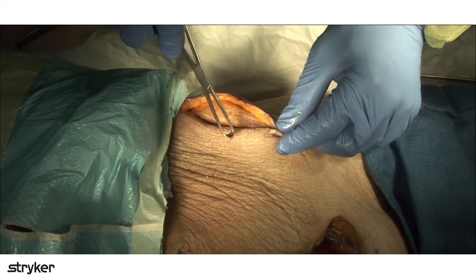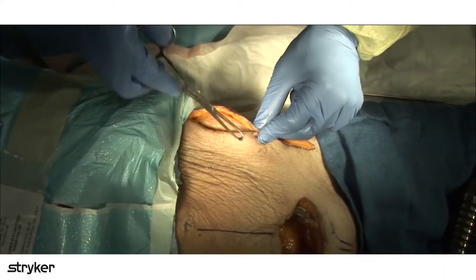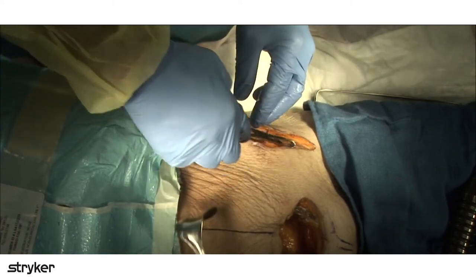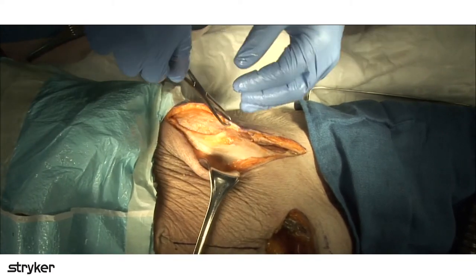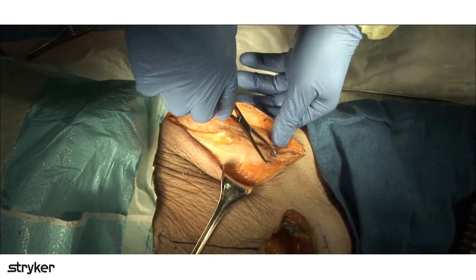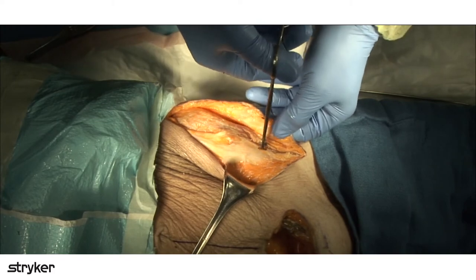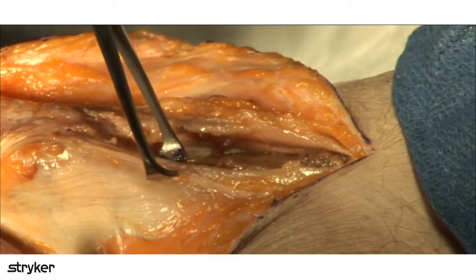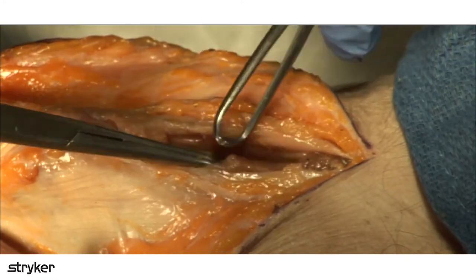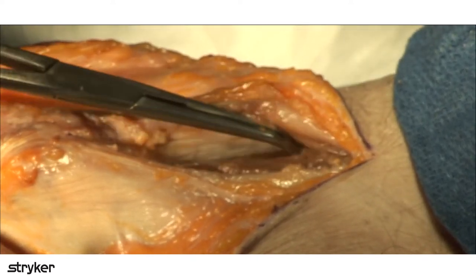But if you're going to do the ASIS osteotomy, it makes sense to keep the incisions separate. So you do your Pfannenstiel in here, you do a standard lateral window incision here, and then curve it down distally in almost a Smith-Petersen-ish interval extending down from the ASIS along where the interval between the tensor and sartorius would be. Then you incise your fascia and find that interval and develop it between sartorius over here more medially and tensor fascia laterally.